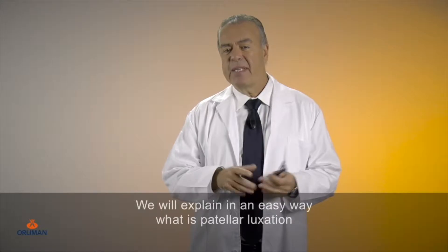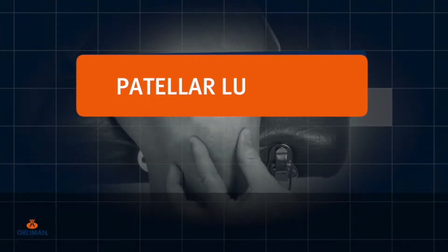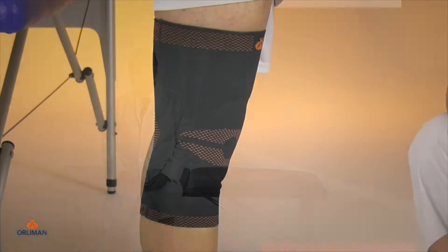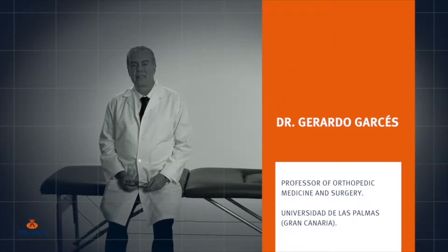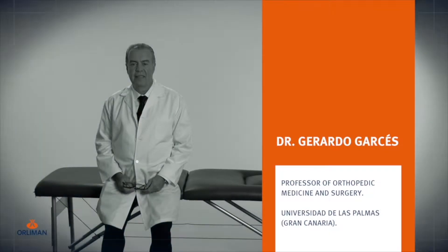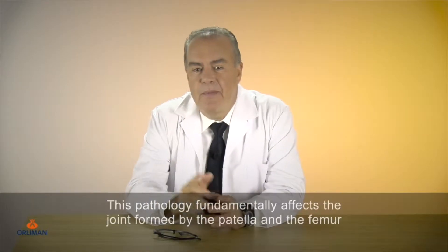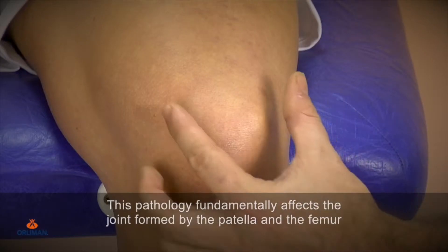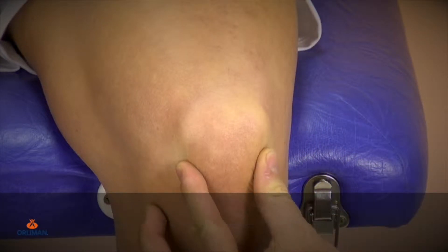We will explain in an easy way what is patella luxation and the recommended orthosis to treat it. This pathology fundamentally affects the joint formed by the patella and the femur in the anterior part of the knee.